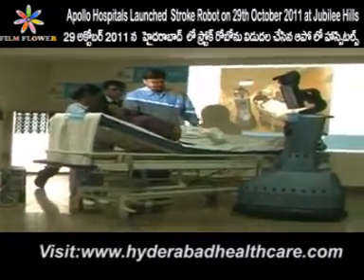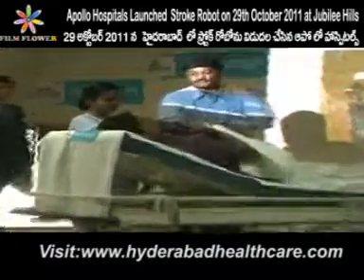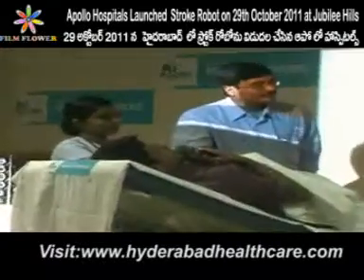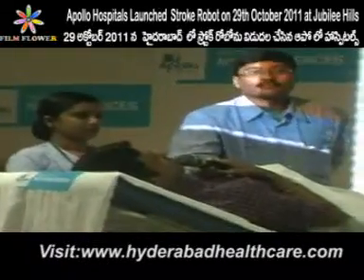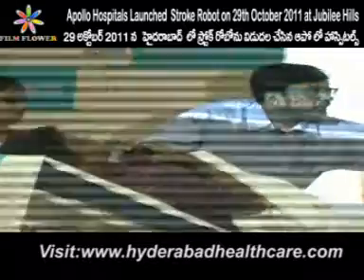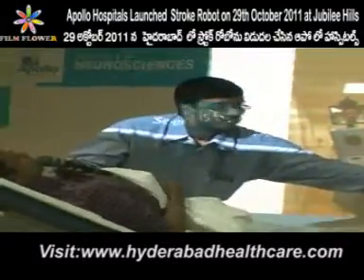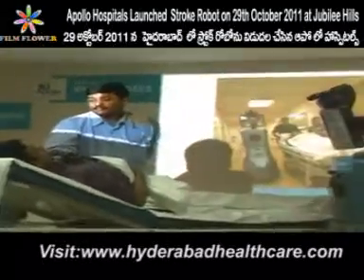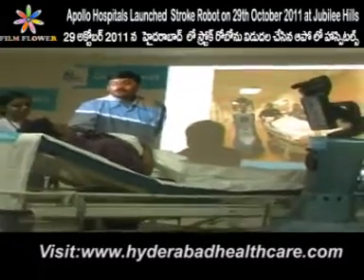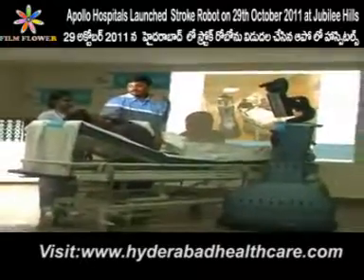So how are you doing? I am actually okay, thank you. Alright, I would like to briefly examine you. Yes, I heard the history of how it started.